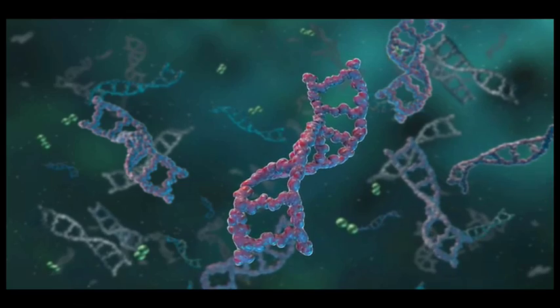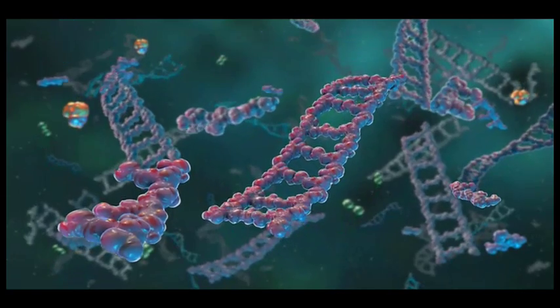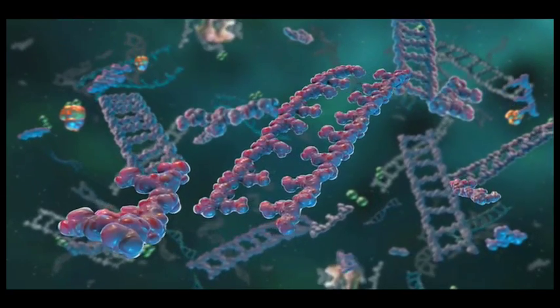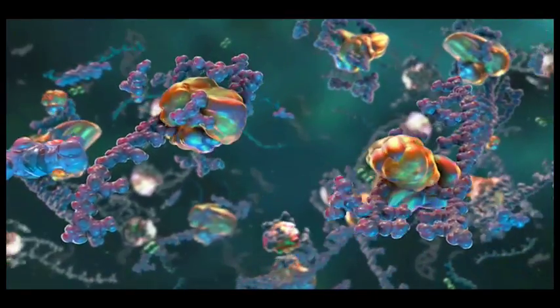Each well of this array is pre-spotted with one pair of second stage PCR primers. These second stage PCR primers are designed to amplify sequences contained within the products from the first stage PCR.